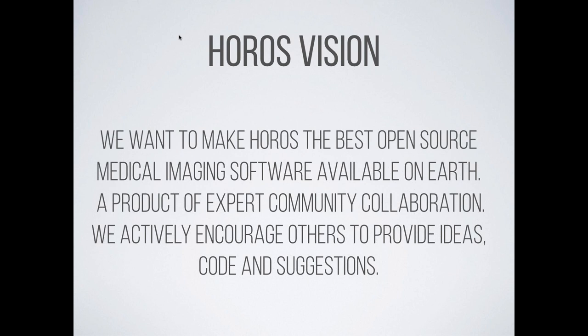We want to make sure that Horos is the best open source medical imaging software available on Earth. That's a big, bold statement, and at Purview, we like big, bold statements, and we think it's critically important to have access to be able to use an open source tool in a way that's meaningful. And what makes it meaningful is for it to be the best in its class.